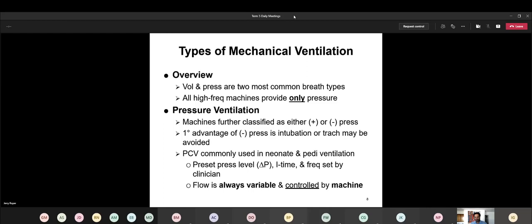And then there's also a concern, usually not that big of a deal, when you have someone in an iron lung for a long time, because it's creating that negative vacuum between your body and the actual machine itself. It's pulling up on your chest and creates that pressure difference so that the air rushes into your airway.